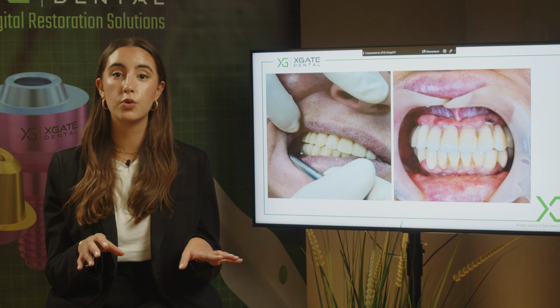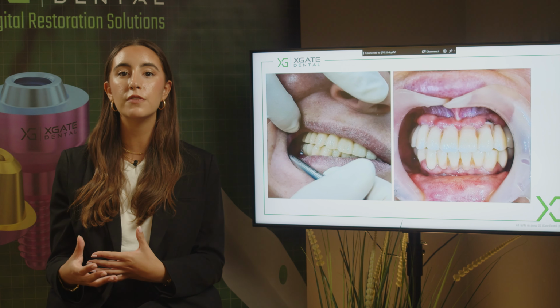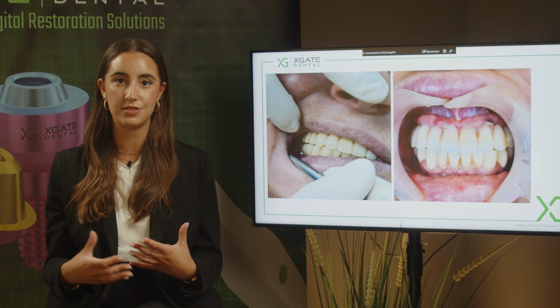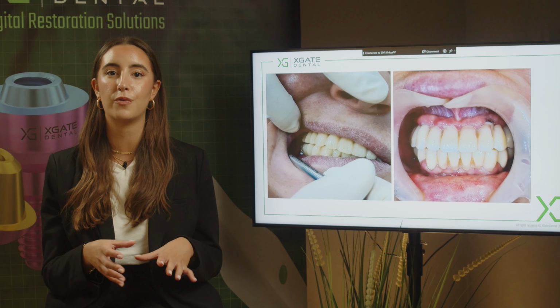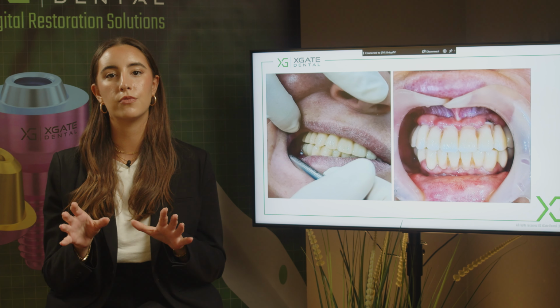What you see in the computer when you design the bridge is not what you'll see in the mouth. It's very hard, even using the most advanced programs with Smile Design and face 3D scanners. It's still very difficult to do it from the first time, from the first temporary bridge. You need to have some revisions.